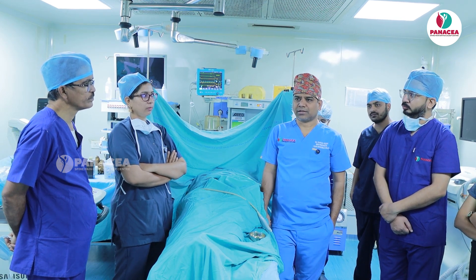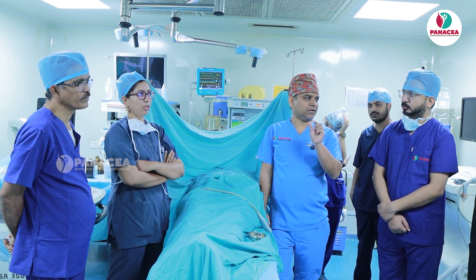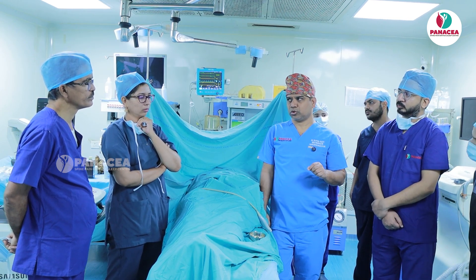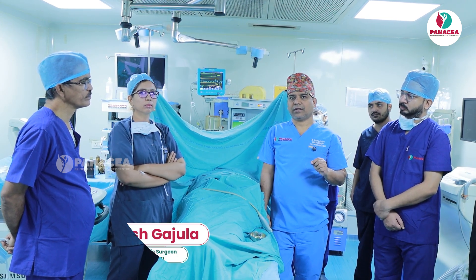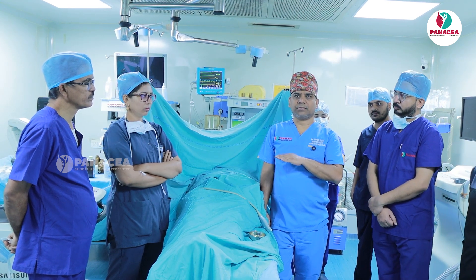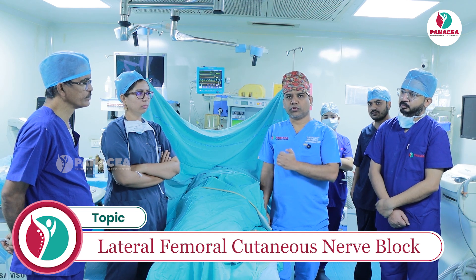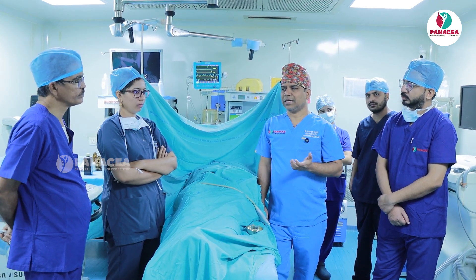The nerve is sometimes 3 to 4 mm thick, so even if there is any entrapment, post-entrapment swelling can be detected and the thickness measured under ultrasound. Previously, before MSK ultrasound, we used to do this blindly. There are 3 to 4 different methods. One method: place the probe four finger-widths below the ASIS; if you slightly flex the hip joint, you can make out a groove between the tensor fascia latae and sartorius. Place your probe there and do a block under short or long axis depending on your skill with the USG probe, or trace it proximally up to ASIS.